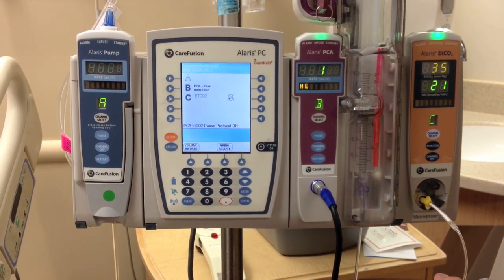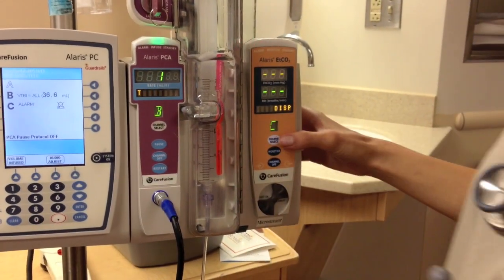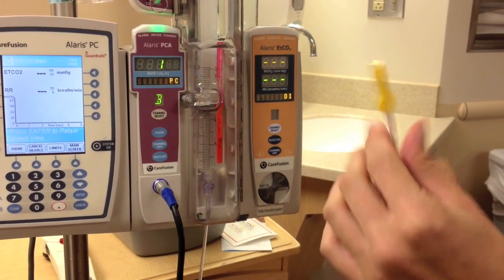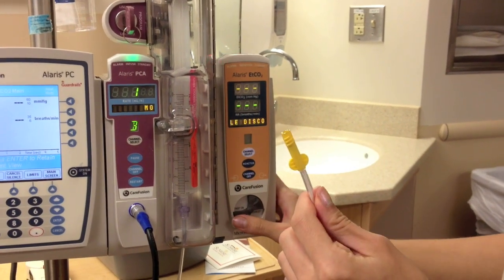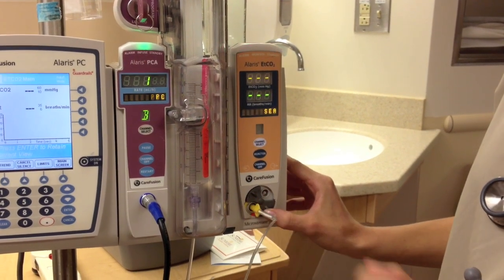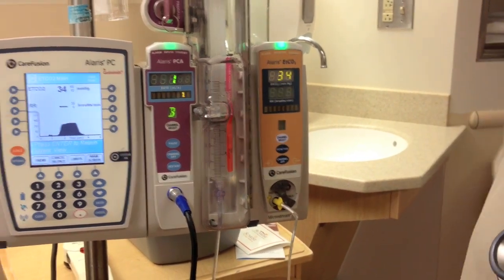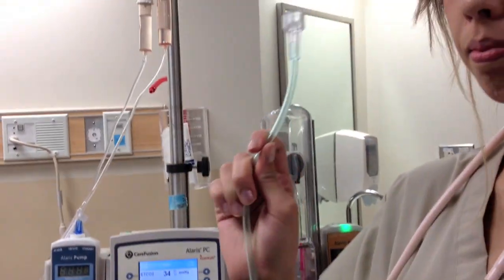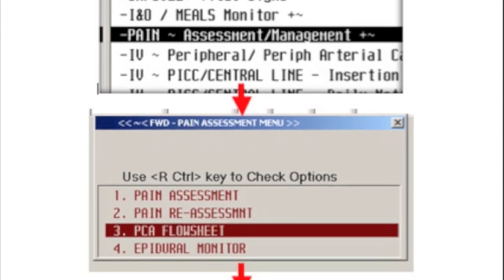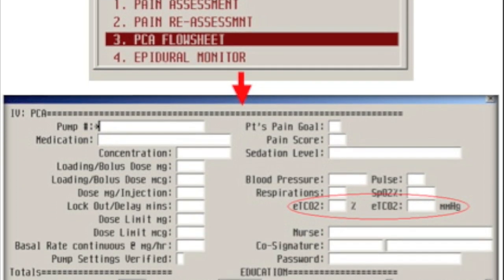Now it is time to set up the end tidal CO2. Channel select on the end tidal CO2 compartment. Take the end of the tubing — which will be yellow — turn the gray dial on the bottom, and twist the tubing into place. Take the oxygen tubing and secure it onto the oxygen. To ensure proper documentation, follow the guideline to write the end tidal CO2 in the appropriate bubble.